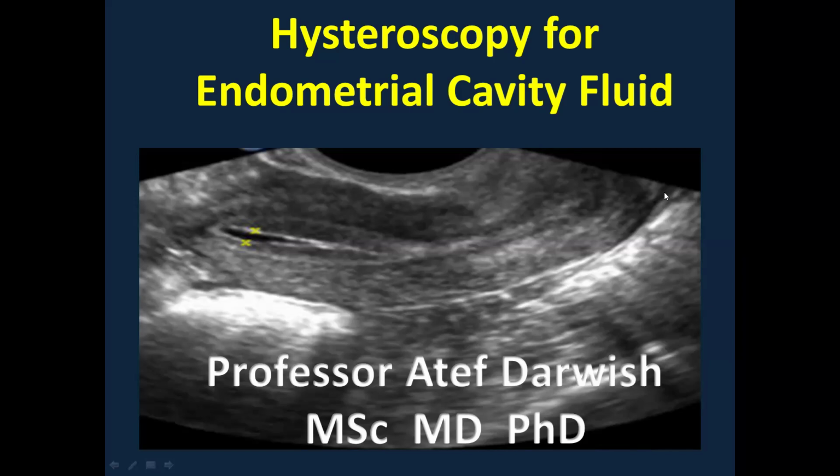Nowadays, we face a lot of cases with increased endometrial cavity fluids that are referred to the endoscopic units for hysteroscopic intervention. And actually, this category of patients were not seen before the interventions by the cesarean section, of course, by myomectomy and other uterine surgery, and also were not frequently seen in the normal patients or the infertile patients, but nowadays is well seen in the IVF-ICSI patients.